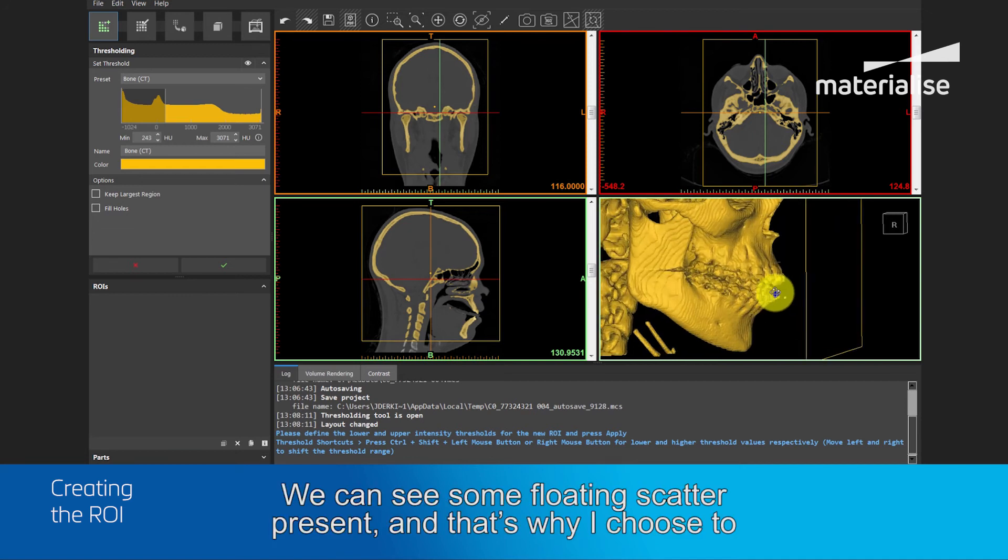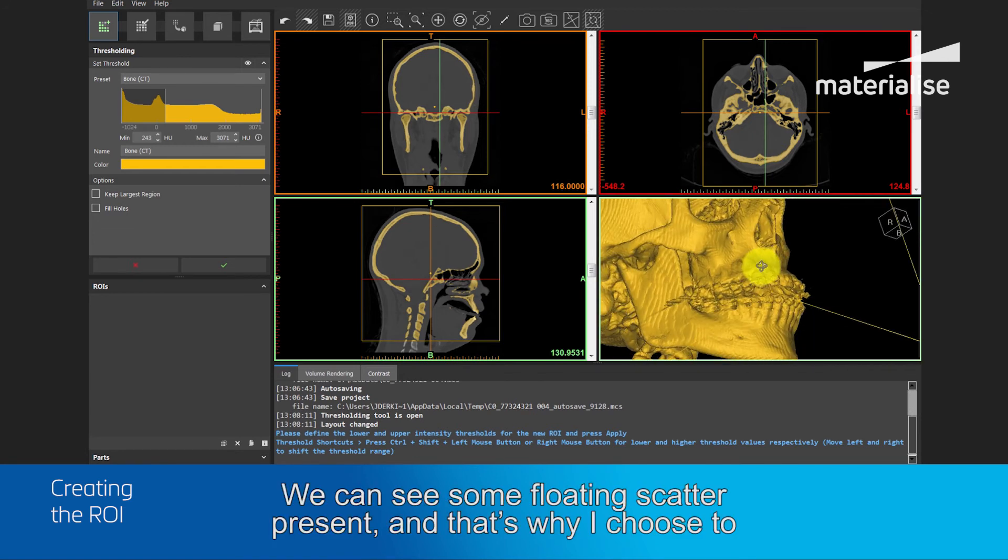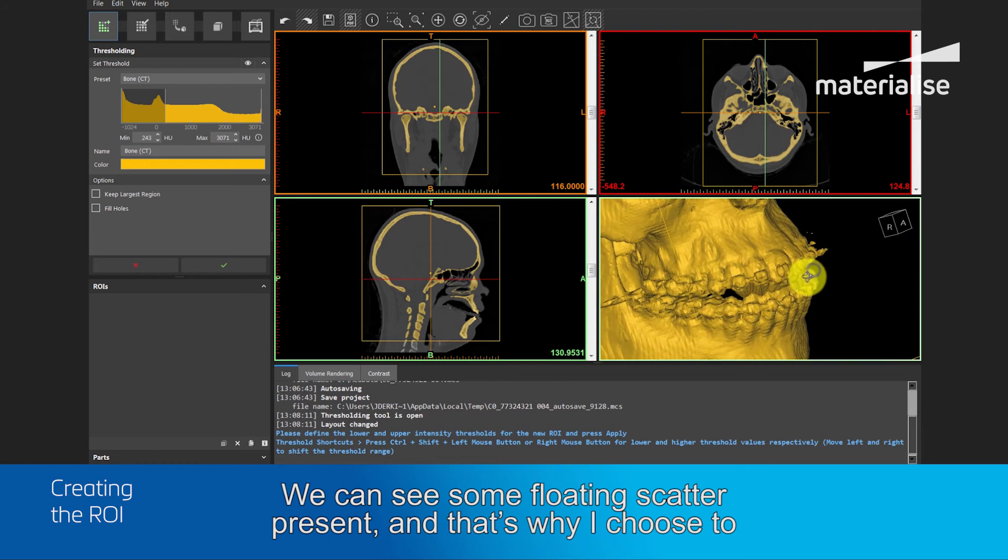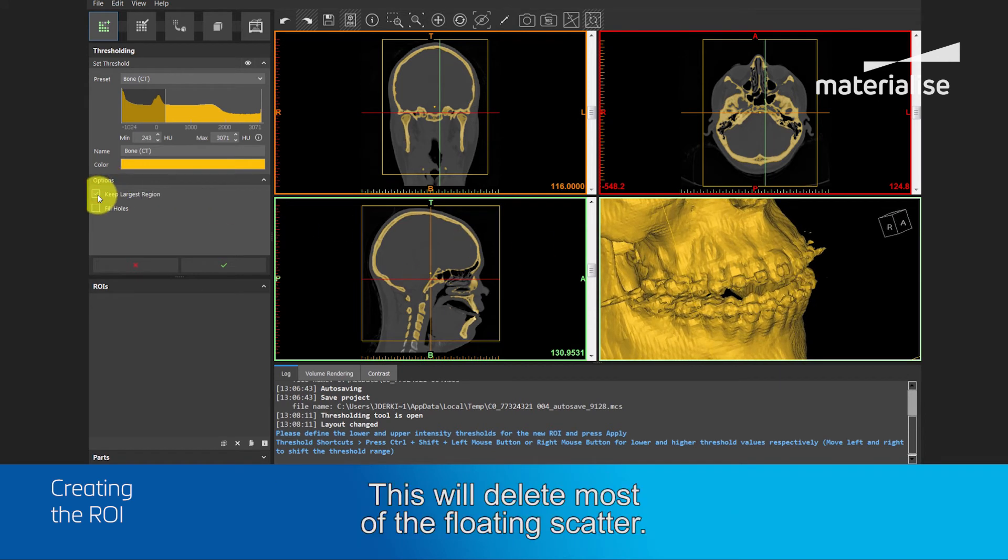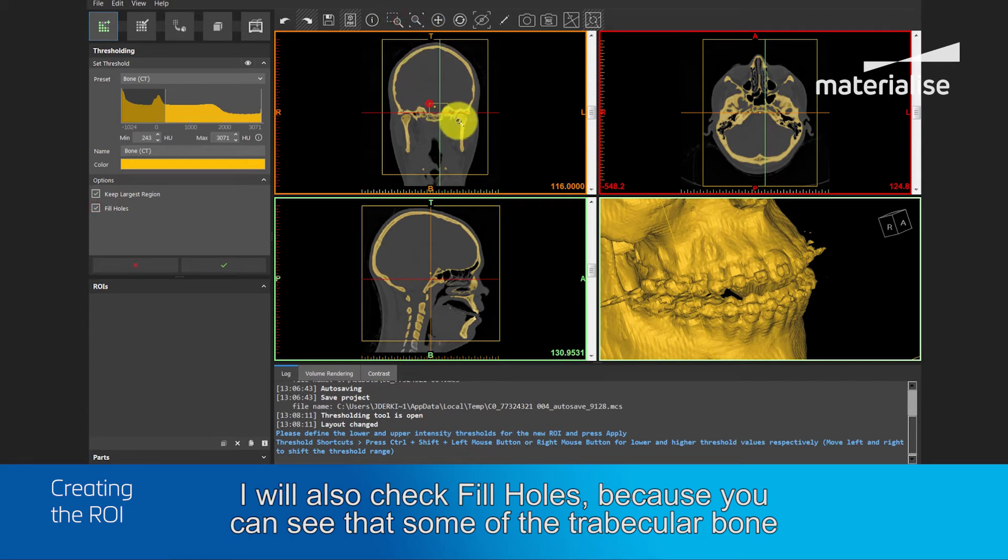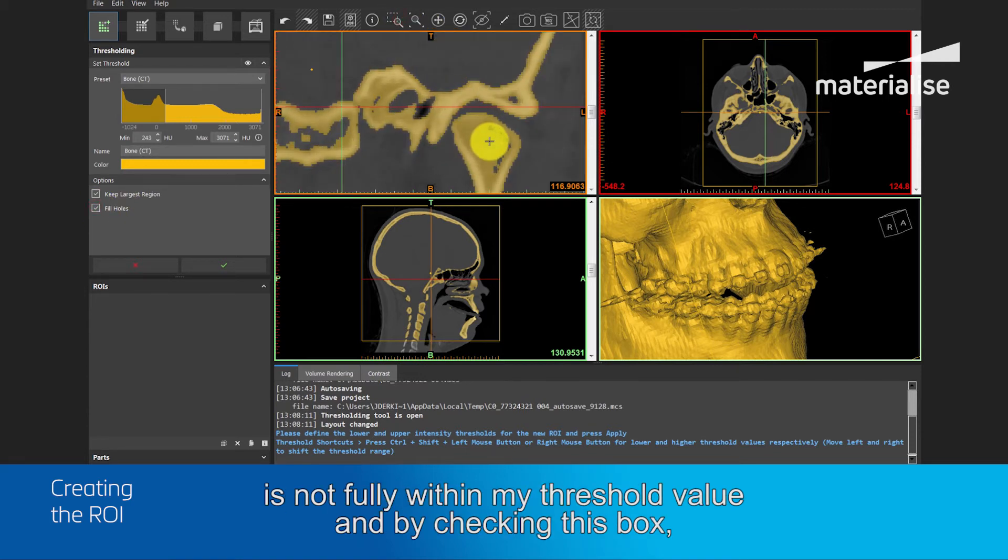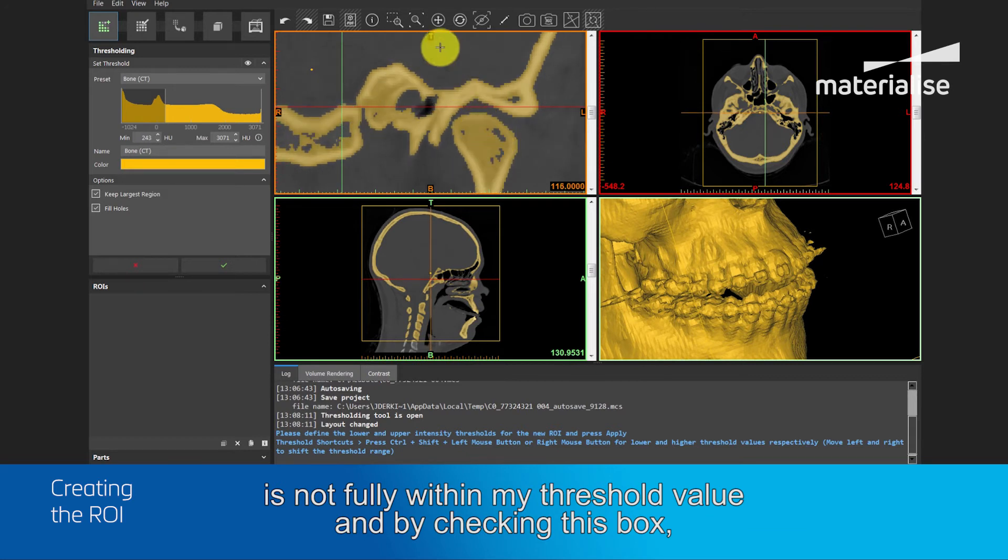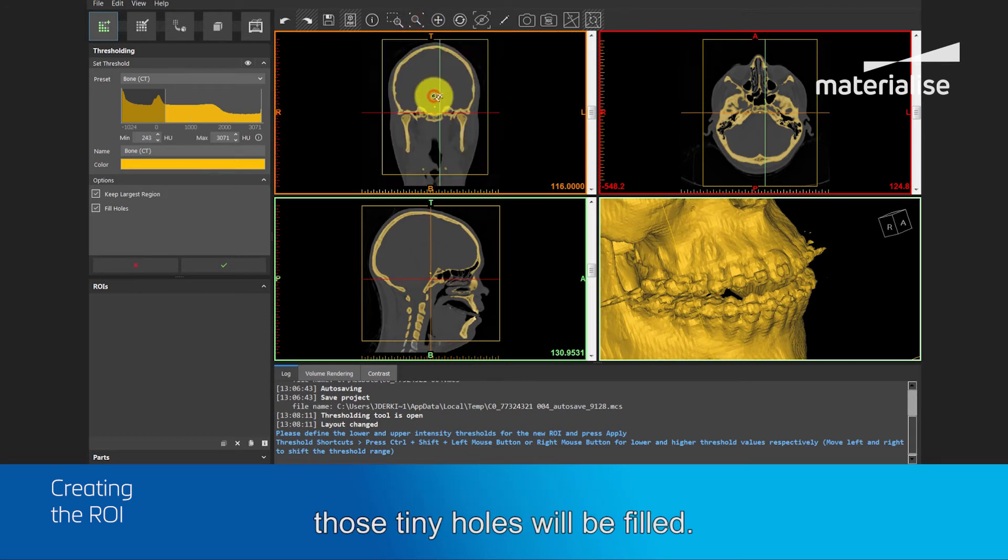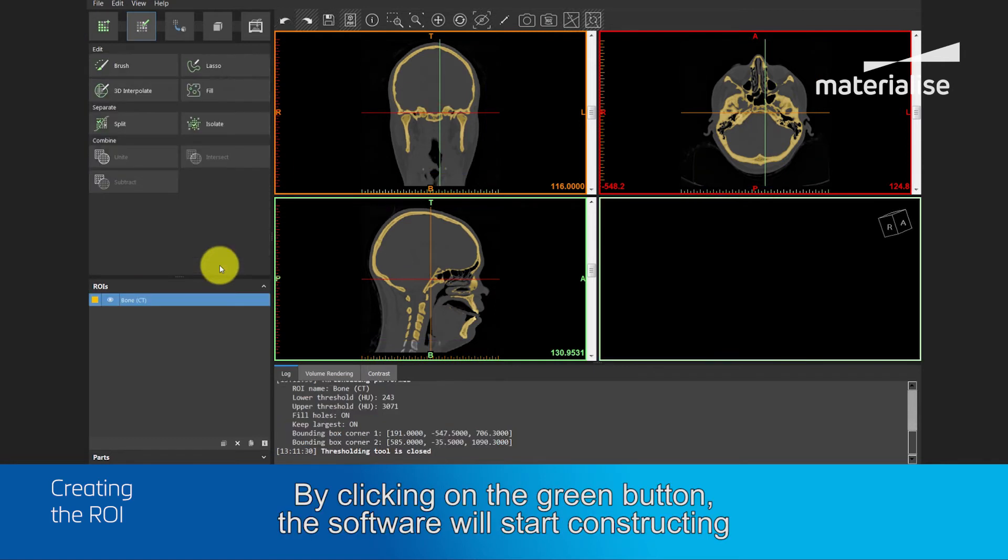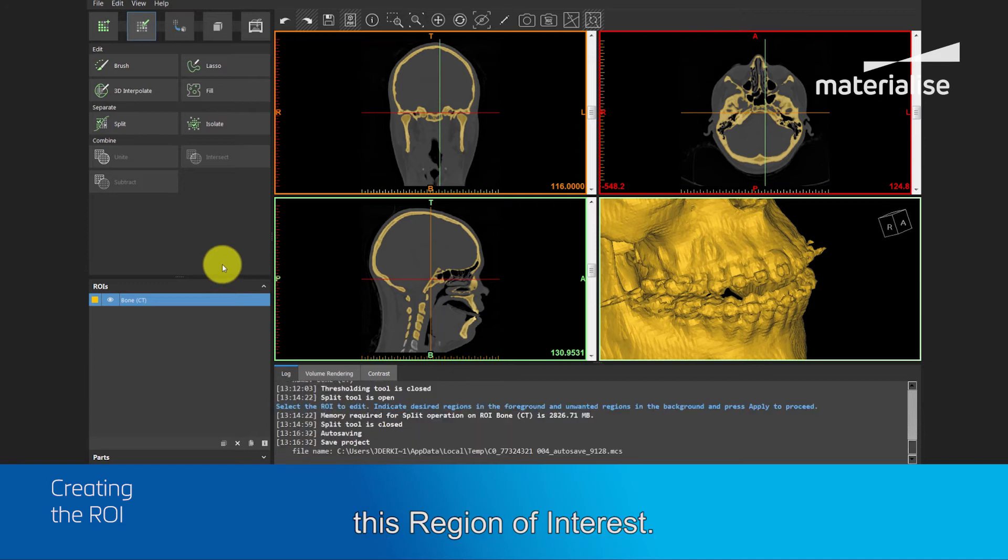We can see some floating scatter present, and that's why I choose to keep largest region. This will delete most of the floating scatter. I will also check fill holes, because you can see that some of the trabecular bone is not fully within my threshold value, and by checking this box, those tiny holes will be filled. By clicking on the green button, the software will start constructing this region of interest.